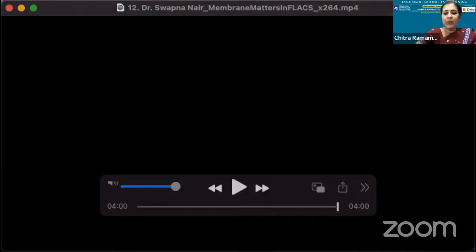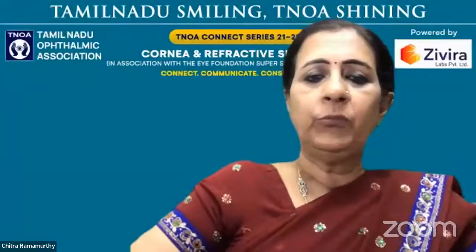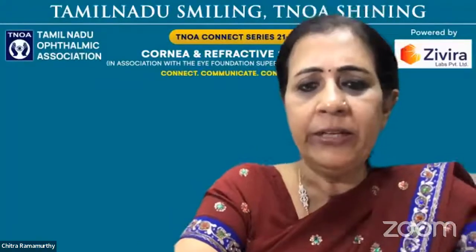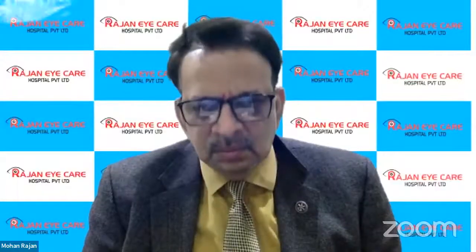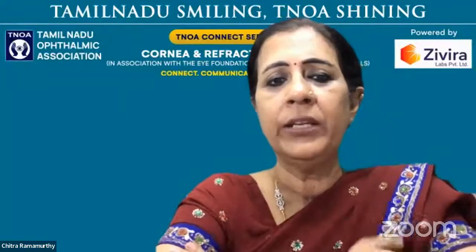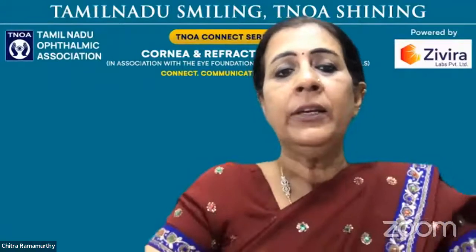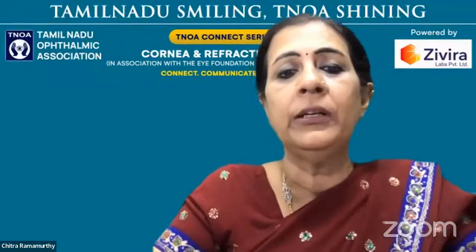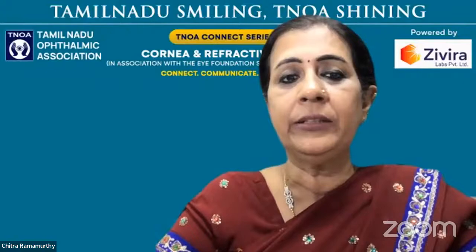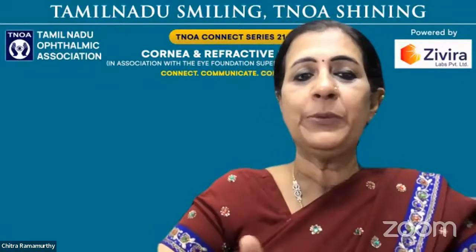Yes, Swapna, that was again a different video which you showed us. Now, I really would want to know, Dr. Anand, it's pretty difficult to create a DMD on a femtocataract platform. Was there some predisposing factor in this particular eye, any history of injury, or is it that when you took your instrument to open up the incision, you inadvertently created the DM detachment? Do you have an explanation for that?